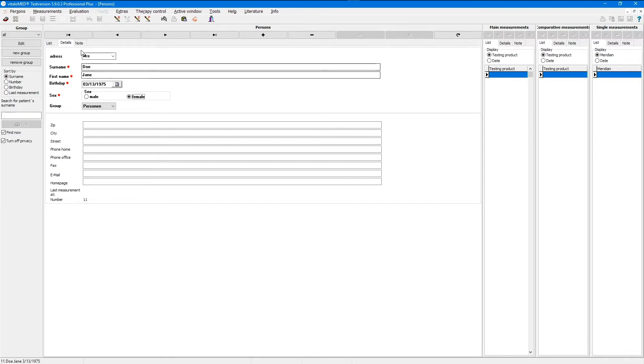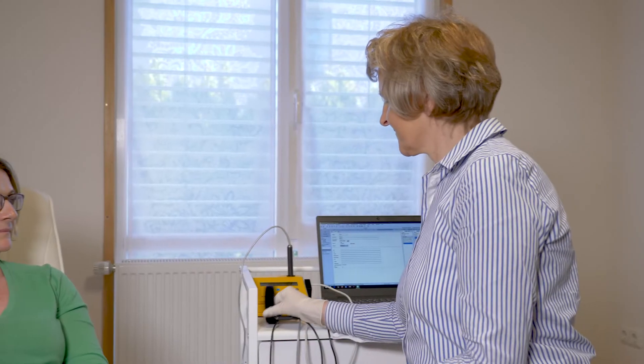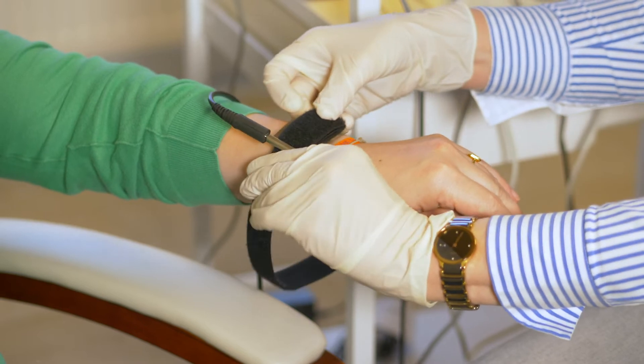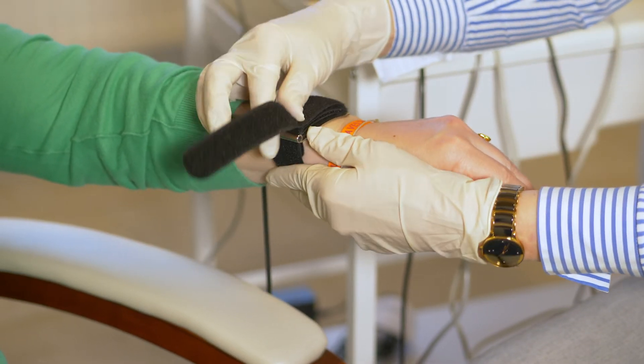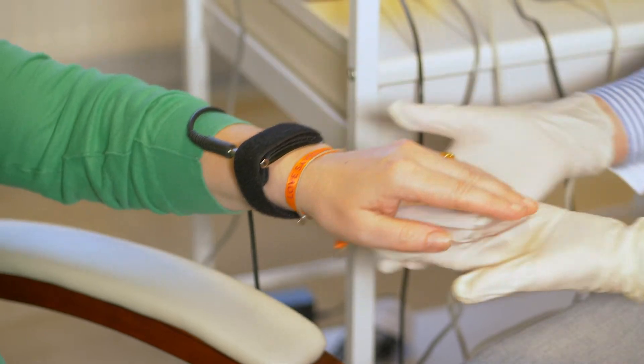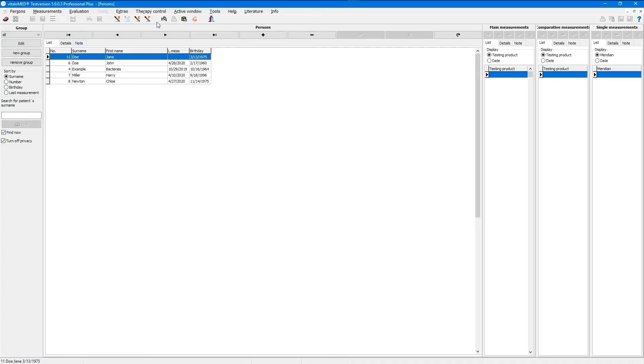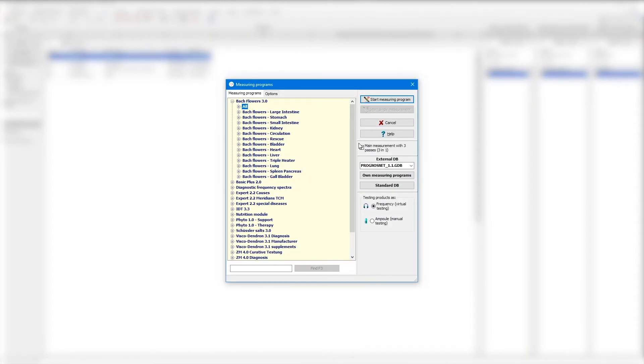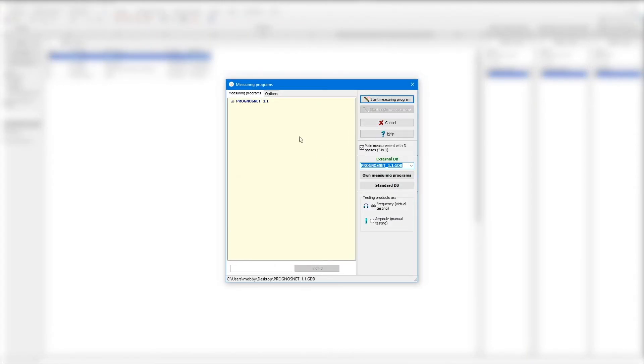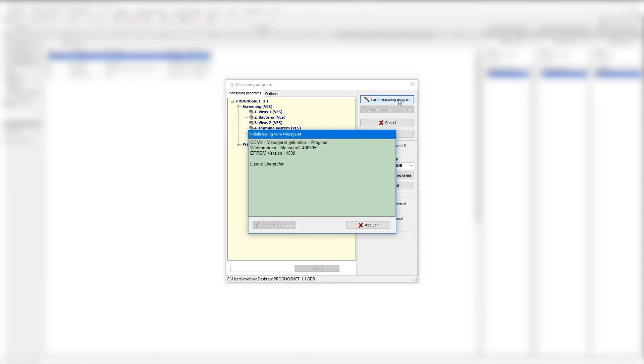Preparing for measurement, the reference electrode is attached with the bare metal side to the skin of the patient's left wrist. Choosing the patient's name, press the button P as shown in the upper toolbar. Then click the external DB for PrognosNet. A window opens. Tap on the plus button in front of PrognosNet and screening VES to open the program for measuring the six wave files or diagnosis frequency spectra. Before starting the measuring program, click the button main measurement with three passes three in one. The three basic measurements are made without frequency spectra.